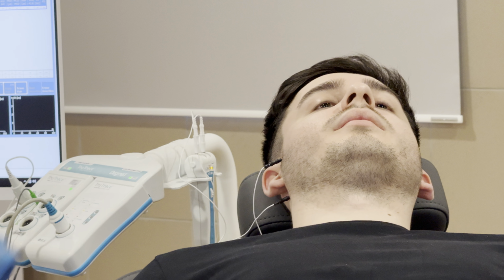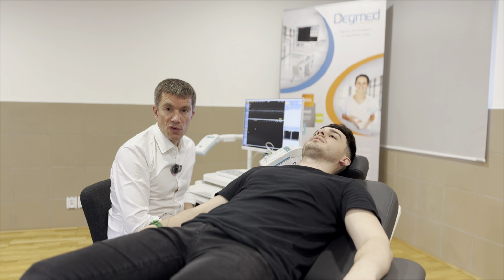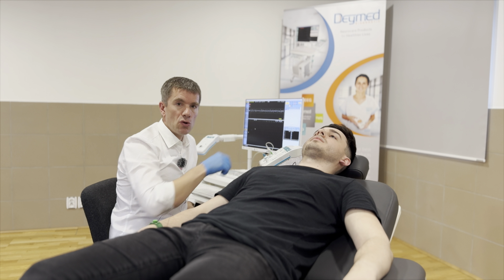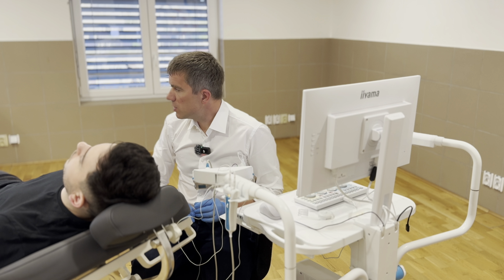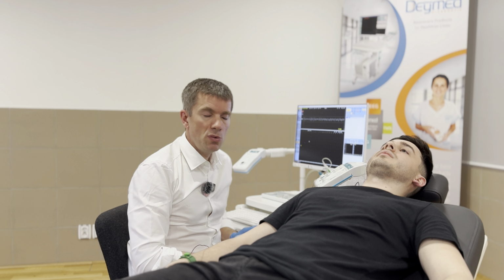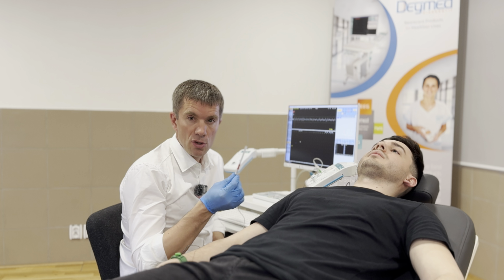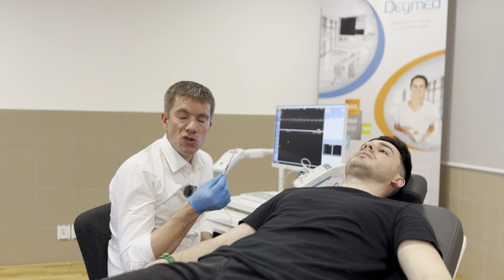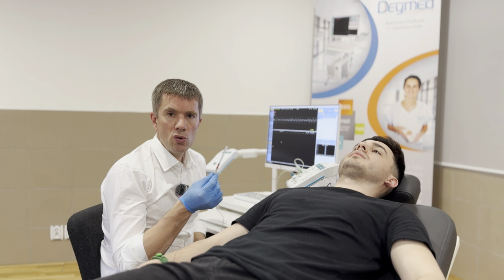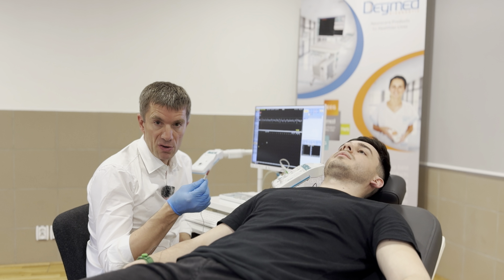So over these two needles we create a certain potential, and this potential will stimulate the muscle fibers of the orbicularis oculi. Whenever we get this kind of blink response due to stimulation, we will insert a concentric needle, the shortest one. We use 2.5 centimeters. We will insert this needle in the orbicularis oculi and try to detect fiber pairs.